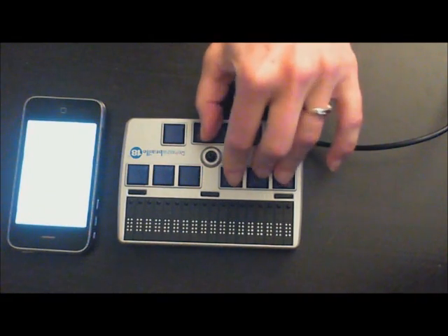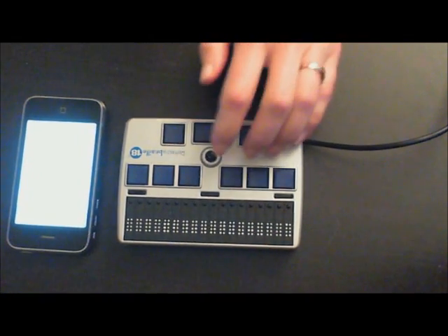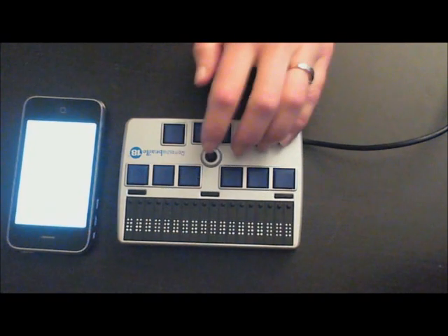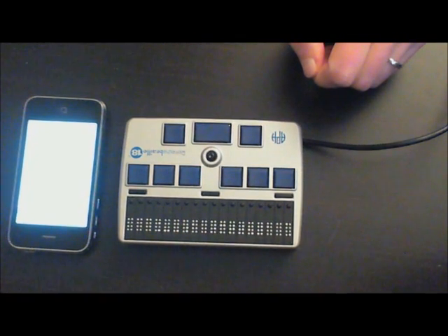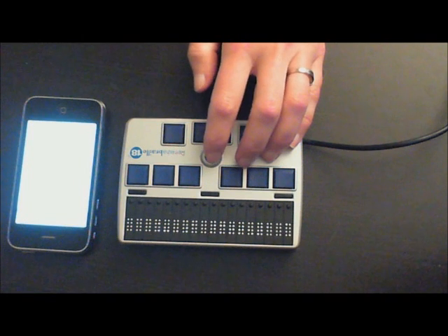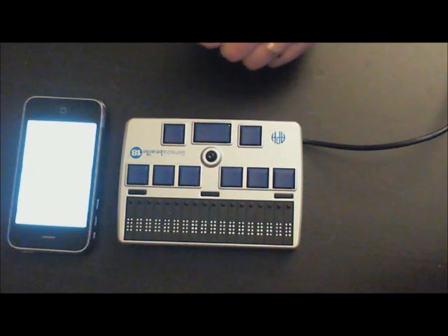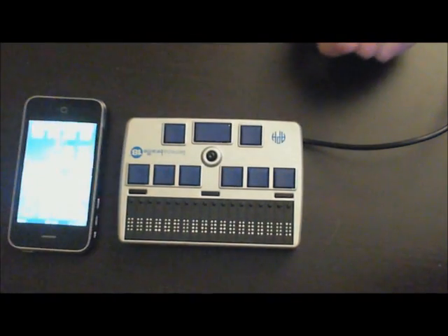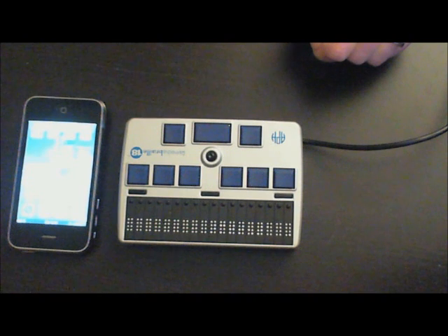I want to go back home, so I'll navigate back through Accessibility and then General. Pressing straight down on the joystick takes me back one level. From General I move back to Settings. Moving through Settings, we can arrive at Bluetooth — it is right there in Settings. If you need to turn on Bluetooth, that's where you find it. To move quickly back to home, press H and space, and you are right back at the home screen.